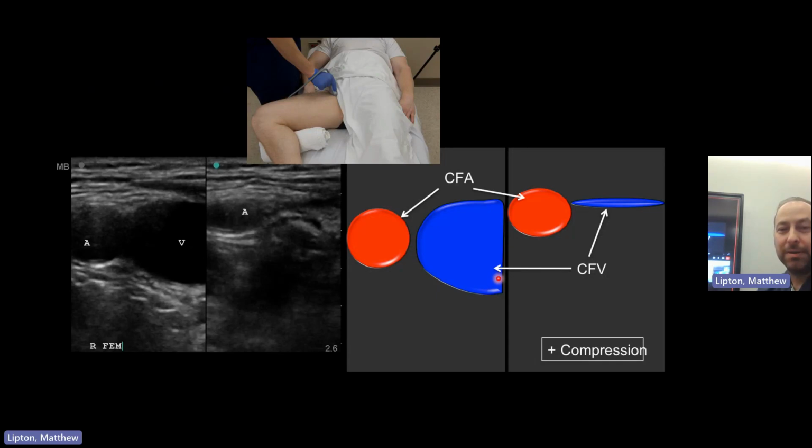So we'll see a better one here. The number one cause of people getting a false negative DVT scan, or at least for me to send them an email, is to not get a compression high enough in the leg. People don't want to get all up in there. So especially in ambulatory patients that have underwear on, people don't go high enough. You need to get all up in there.